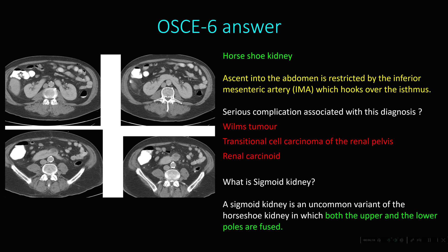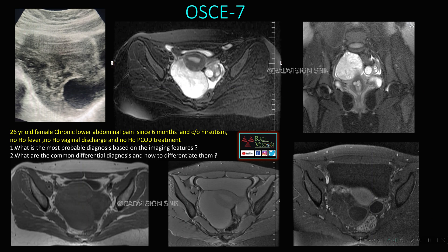A sigmoid kidney is an uncommon variant of horseshoe kidney in which both upper and lower poles are fused. Next, here you can see a 26-year-old female with chronic lower abdominal pain for six months, complaints of hirsutism, no fever, no vaginal discharge, and no PCOD treatment. The right ovary is completely enlarged with peripherally placed dilated follicles.